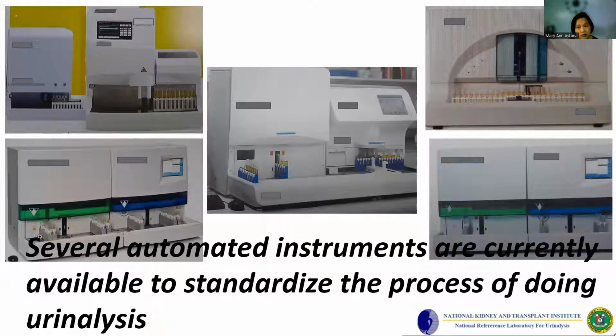So we should consider redundant data entry, also called double entry. Redundant data entry involves 2 separate people entering the data, with data only flowing forward if the two independent entries match. Each system uses a different technology to classify and quantify urine sediment particles and offers an improvement in standardization over manual microscopy by eliminating potential intertechnician variability during slide interpretation.